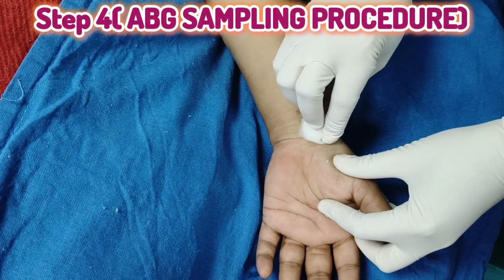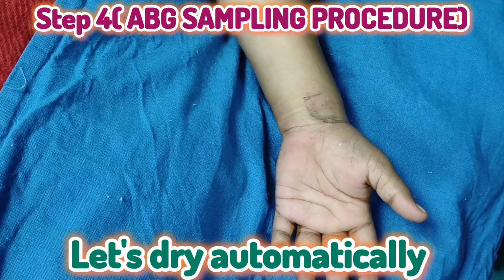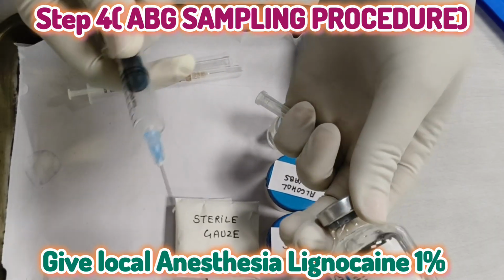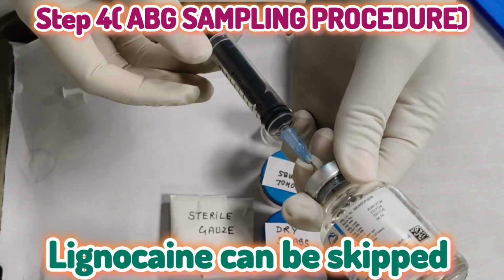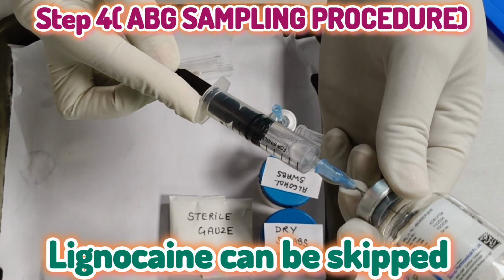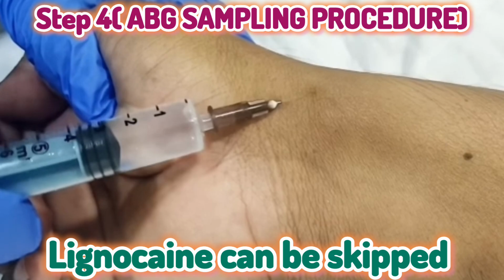Step 4. ABG sampling procedure. Clean the site with an alcohol swab. Let it dry automatically. Give local anesthesia, lignocaine, in case of repeated ABG sampling or sensitive patients, to reduce pain and for better cooperation of the patient. We can skip lignocaine in emergency situations, unconscious patients, deeply sedated patients, cardiac arrest and severe shock conditions. Why? Because in these cases, time is more important than pain control.